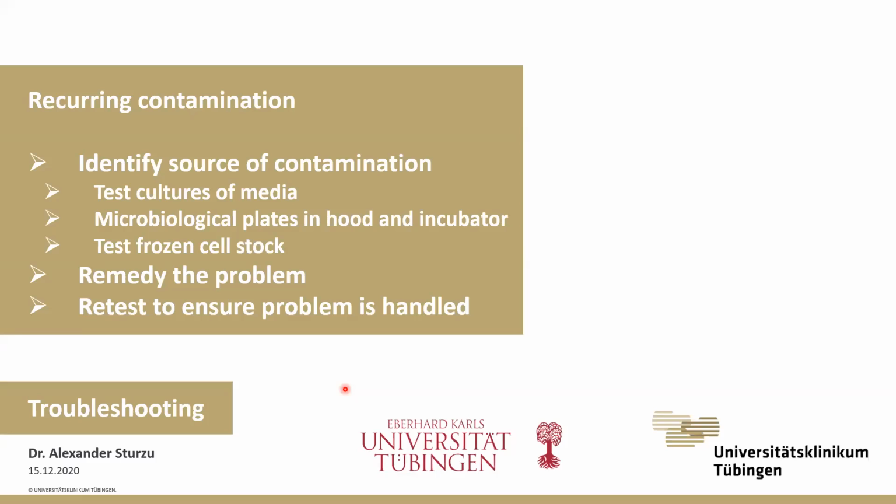And then before you start your cell culture again, you should first test if you really removed the contamination. Otherwise, you would start the work, and instead of wasting 3-4 days just testing if your setup is clean again, you would also waste your valuable cells and research materials if you get the contamination again because you didn't clear it properly in the first try.